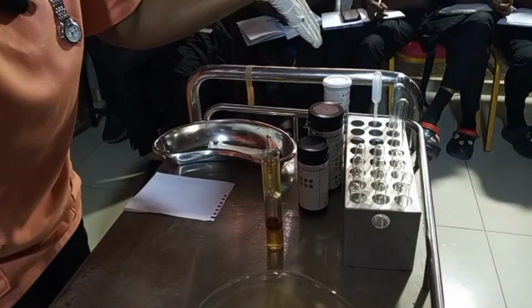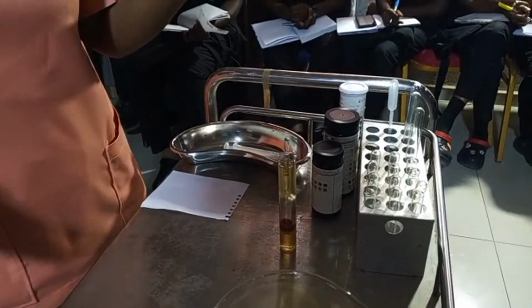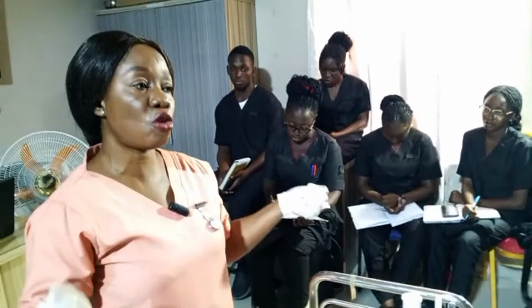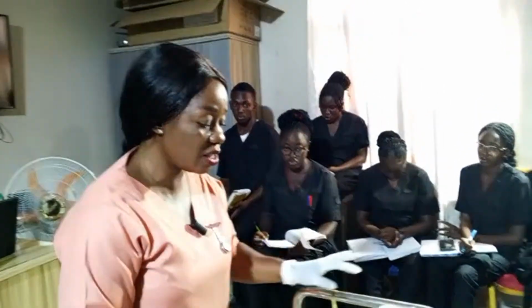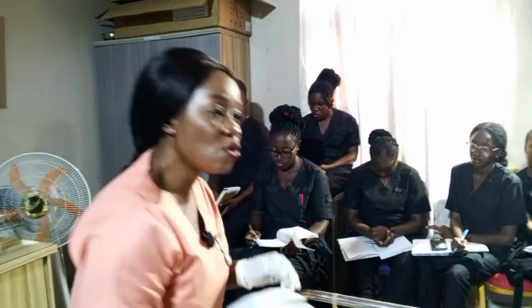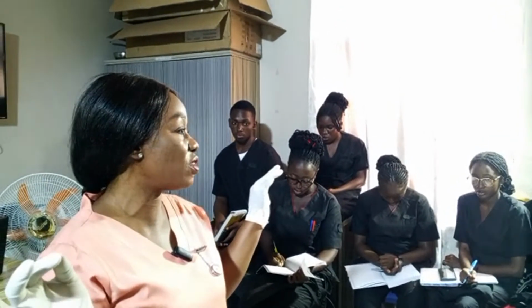Do not touch the trolley or the table that you are using. If it is a table, maybe it's better because the table may be strong and heavy. But if you are using a trolley like this, please avoid shaking it. Look at it now, it's shaking, right? So it may shake the urinometer and you may not get the specific gravity of the urine rightly.